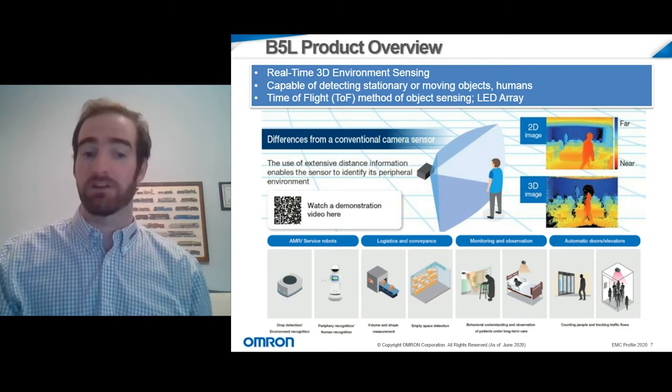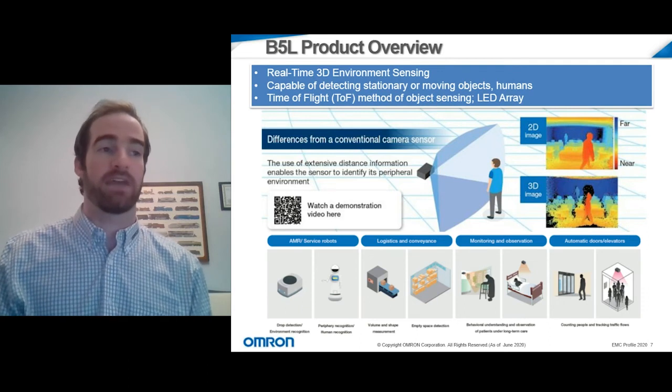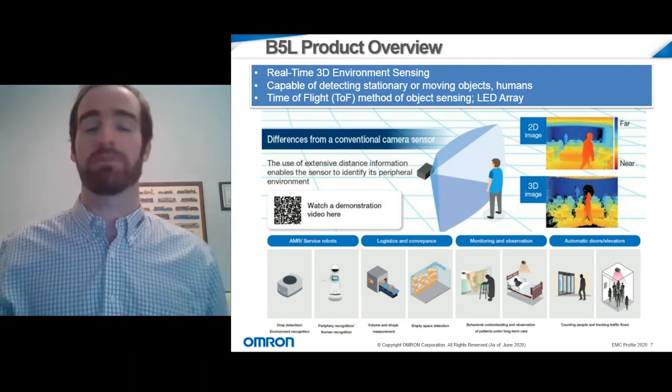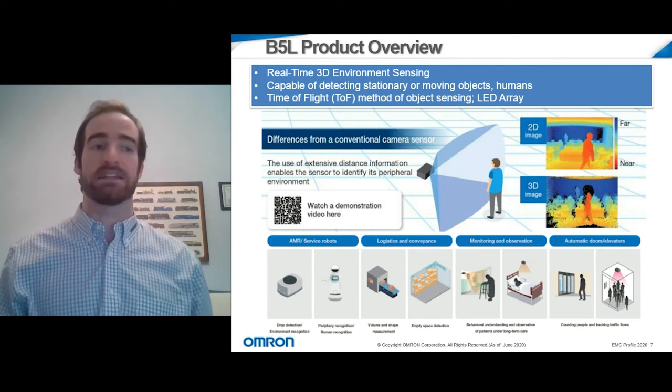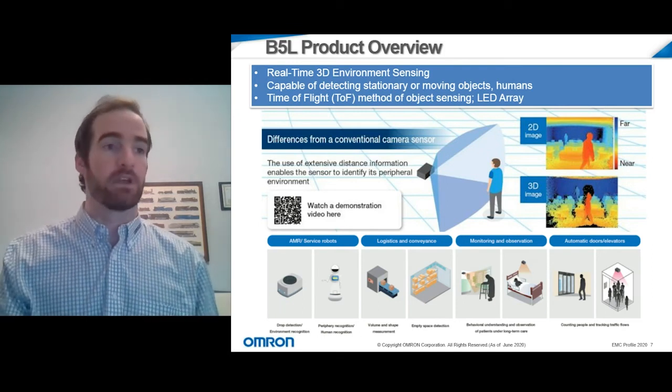The sensor's ability to read motion in real time is a perfect reason for it. And then, of course, being able to read that distance data to see whether they're upright, laying down, or may have fallen over.